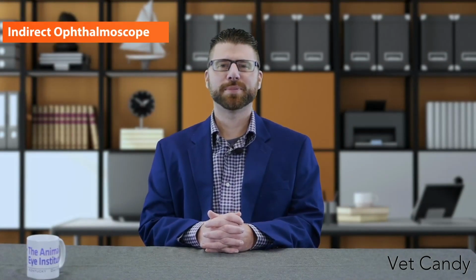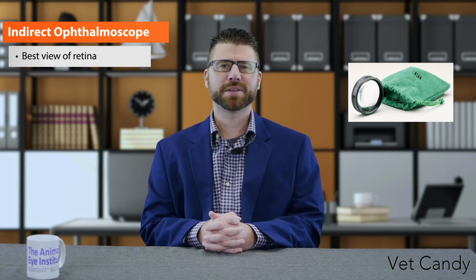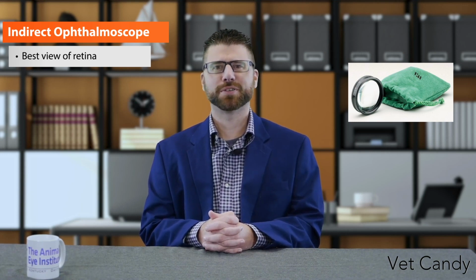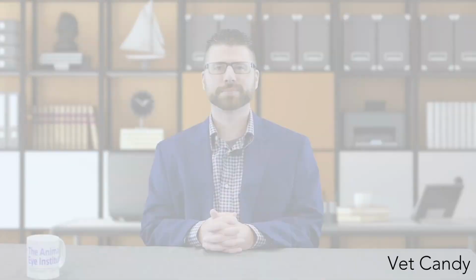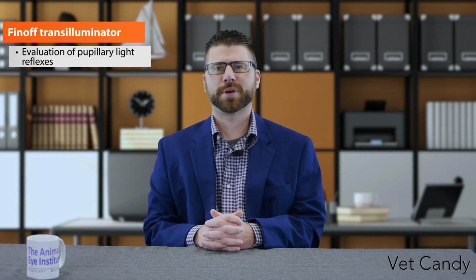Indirect ophthalmoscopy provides the best view of the retina by far. Lenses can be purchased on Amazon around $100 for a 20 diopter lens or through various veterinary companies. The view of the retina is far superior compared to a direct ophthalmoscope. A Finoff transilluminator is a halogen focal light source. It is typically used to evaluate pupillary light reflexes. However, it's a light source for indirect ophthalmoscopy.